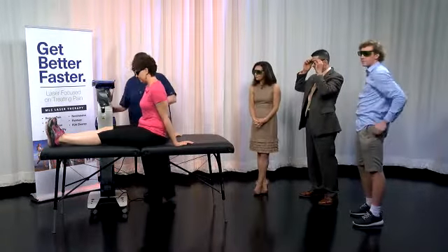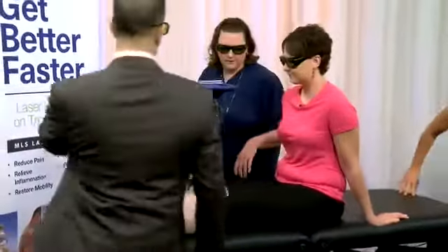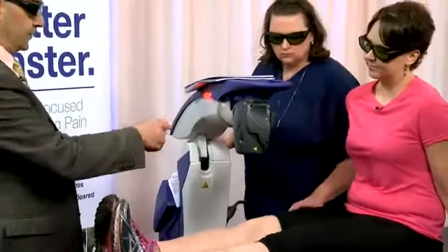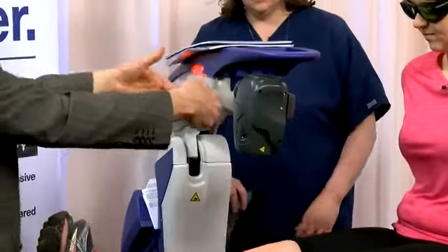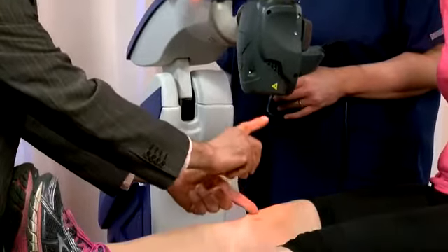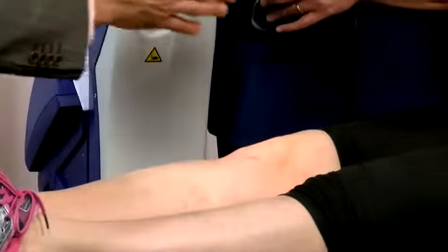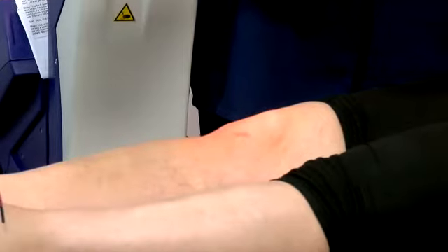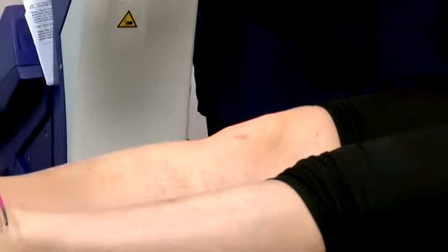This is a robotic ultra head right here. It actually has three laser diodes in a triangular array. Those three diodes each emit a laser beam, and that beam concentrates eight inches away — that's why this is held eight inches away. The nice thing is it doesn't have to touch a patient if they're in pain. There are certain settings for this. If a patient came in with a lot of pain, we might have it set at 2000 Hertz.